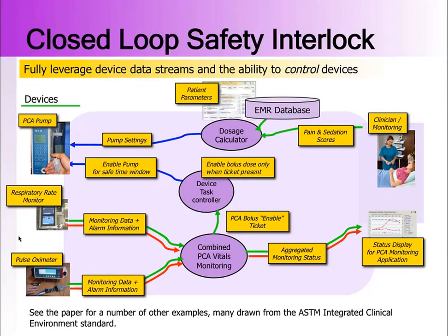So, again, the problem is, in the medical space, not only are we lacking technology for having this platform approach, we're lacking interfacing technology, and this is something that the folks from NIST who are on this call also work on.